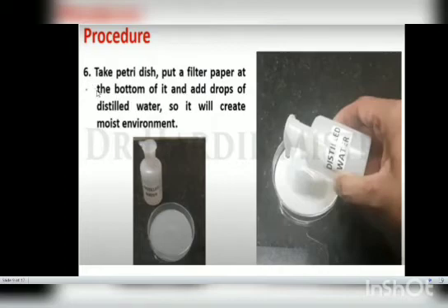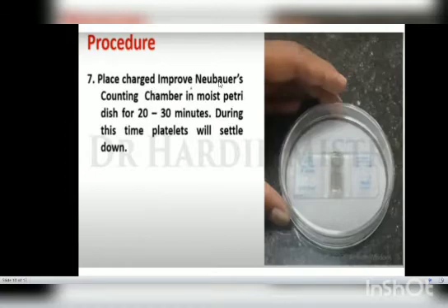In the sixth step, take a petri dish and put a filter paper at the bottom so that the environment inside is moist. Put distilled water around the filter paper. Then place the charged improved Neubauer counting chamber in the moist petri dish for 20 to 30 minutes. During this time, the platelets will settle down.